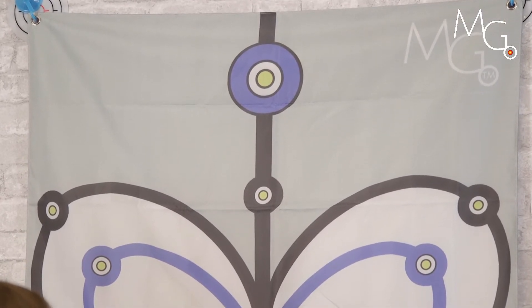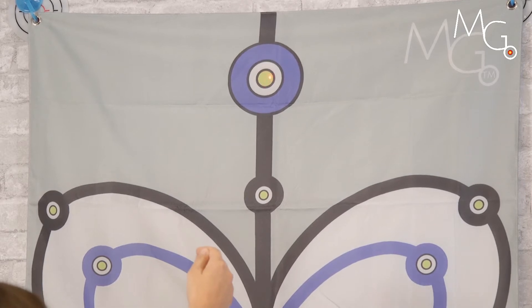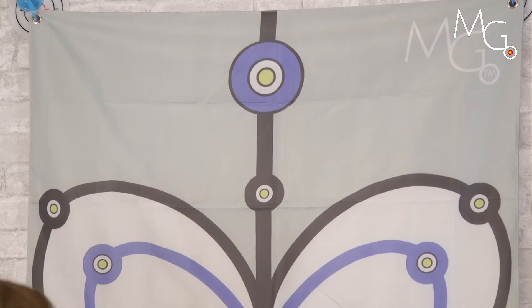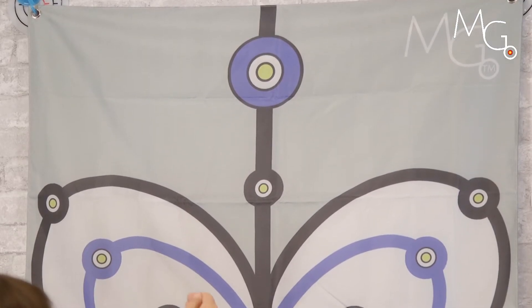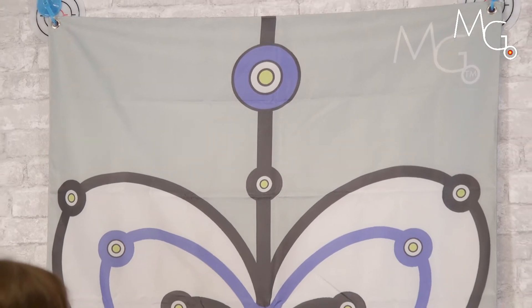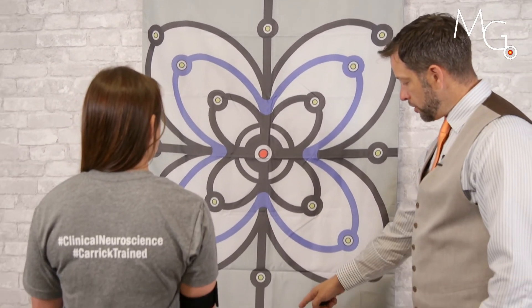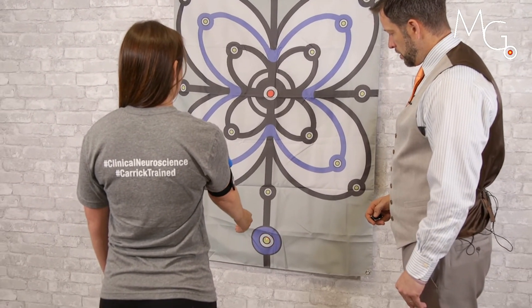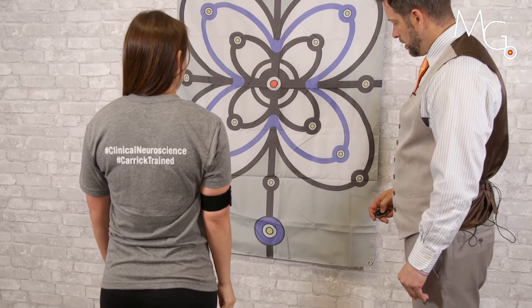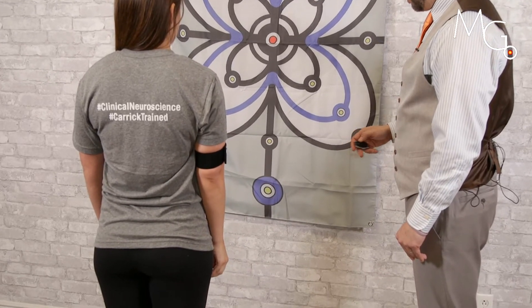And again, come back down. Take the visual feedback away and have them reposition. Come back down and take the visual feedback away.